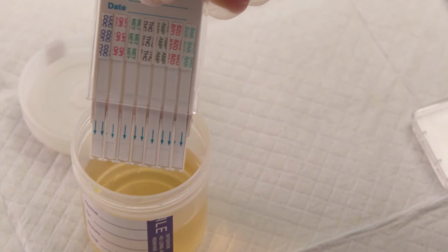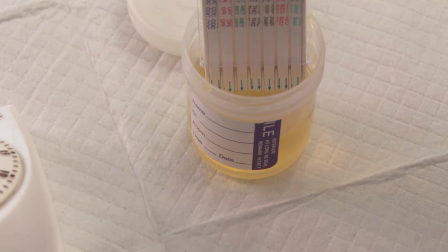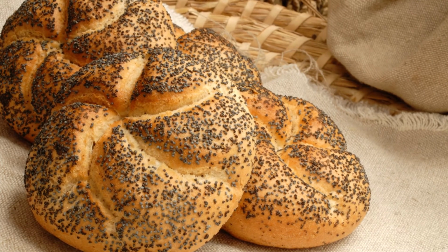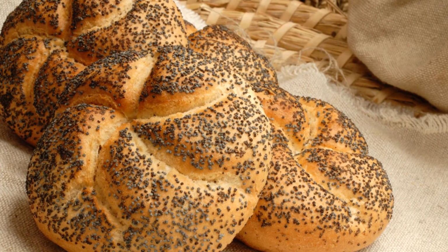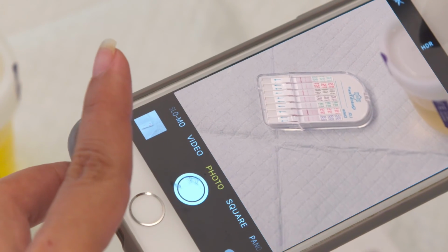If the results do not change from one test to another, it is possible that either the participant is not telling the truth or the result is a false positive. False positives are rare, but they do happen. Check with the PI or a study clinician to see if a medication a participant takes, or something the participant ate, may be causing cross-reactivity with the test. Make sure any discrepancy is well documented.